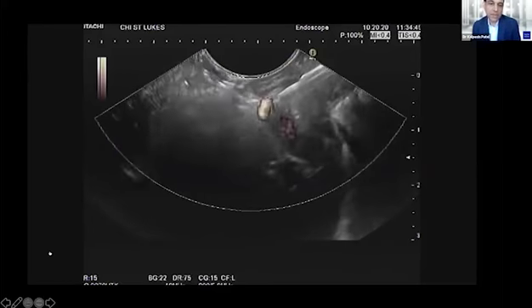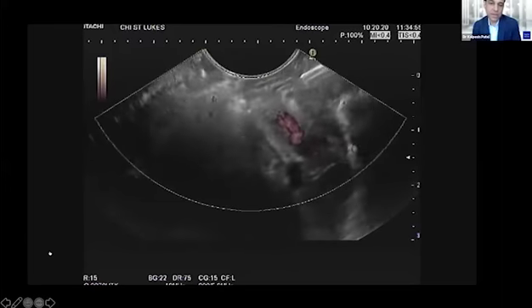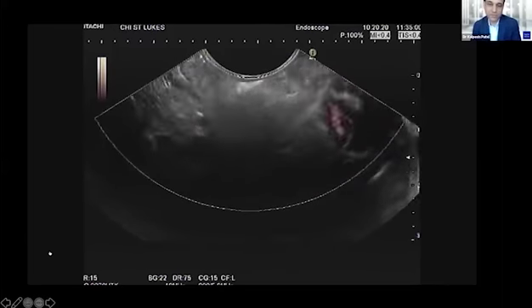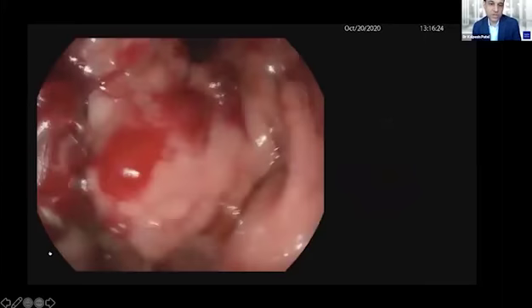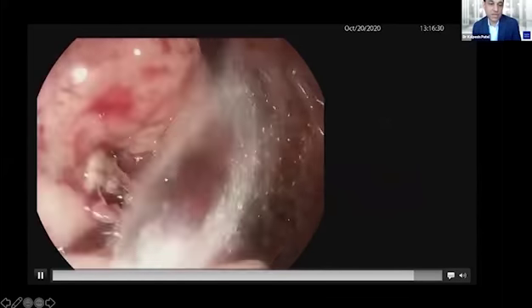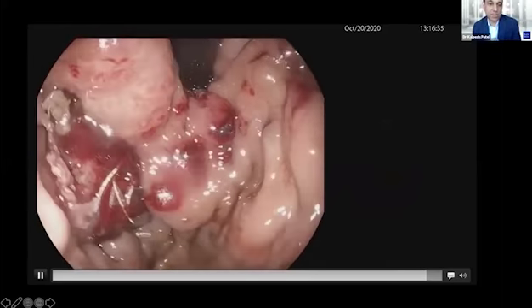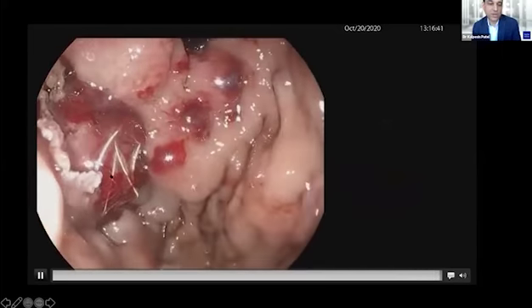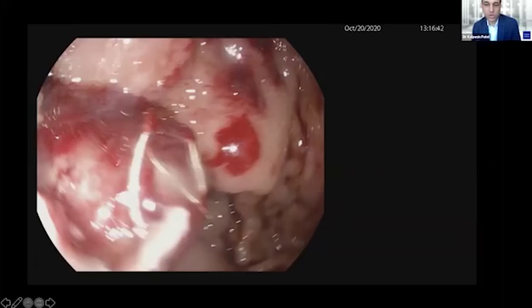Okay. Endoscopically, so then I remove the echo endoscope and we'll re-examine endoscopically to assess for ongoing bleeding. And we'll take a look at that here as we switch to the endoscopic view. And here, done in retroflexion, we can see very clearly the extruded coil right here. You can see some of the extruded glue as well. And this varix has been nicely decompressed. Looks like there may be another one to treat down the road. I typically try to reserve to the largest one on the initial or the bleeding one if it's clear which one's bleeding.